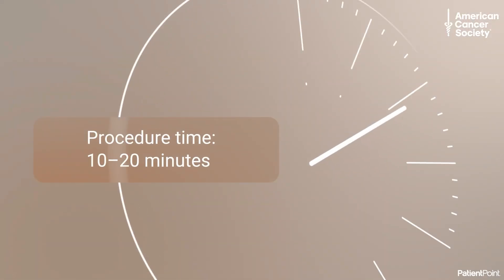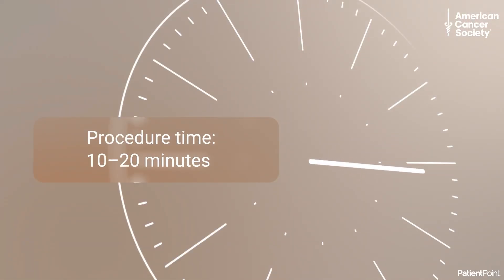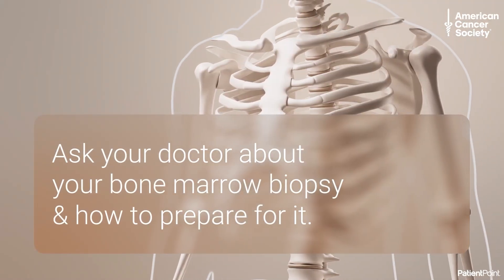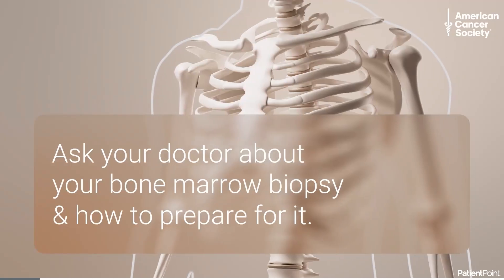The entire procedure should take about 10 to 20 minutes. Your doctor sends your bone marrow samples to a lab for testing. Ask your doctor any questions you have about your bone marrow biopsy and how to best prepare for it.